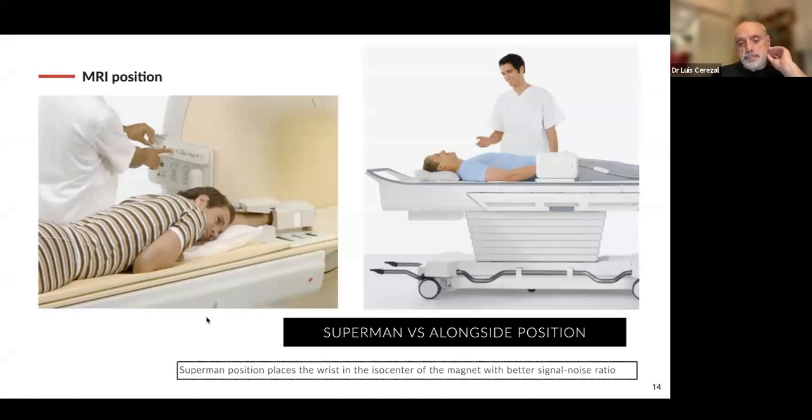But the position of the patient is also really important. The planning for me is essential. We could perform the studies in prone position with the patient in Superman position, and this is uncomfortable for the patient, of course.